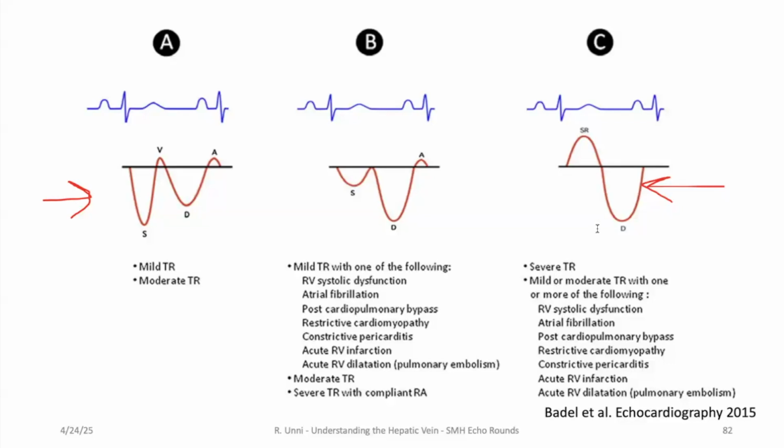You may not be able to rely completely on the hepatic vein waveform, the more issues you have with the right side. Okay, that's a big topic. So let's keep moving.